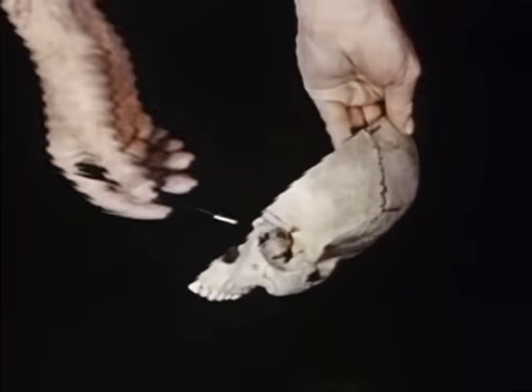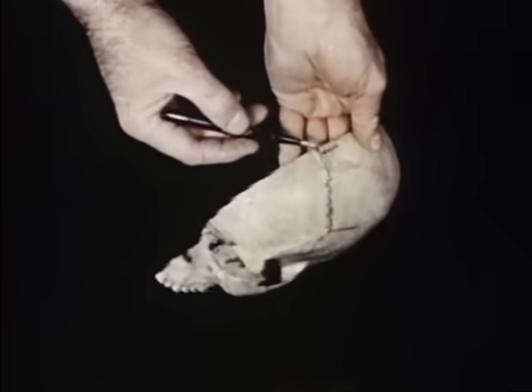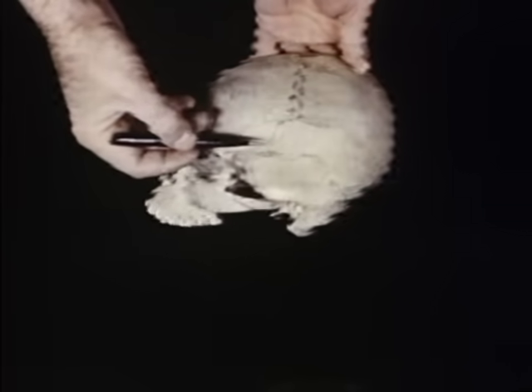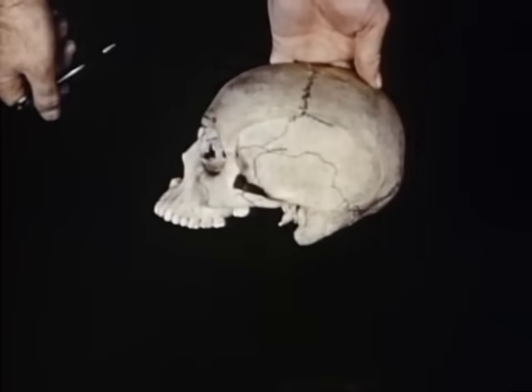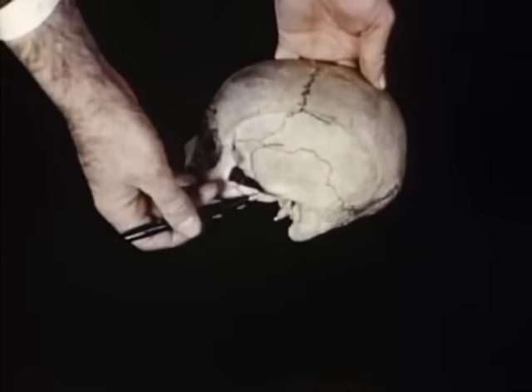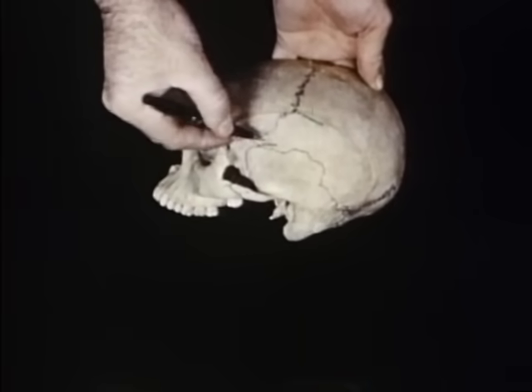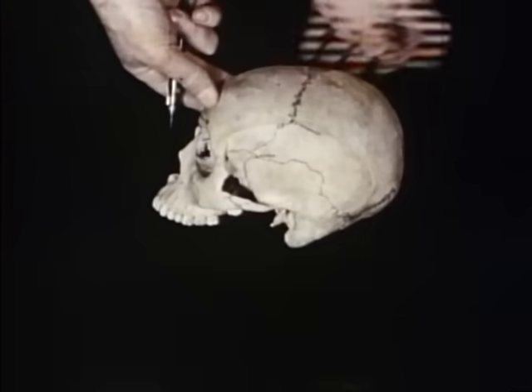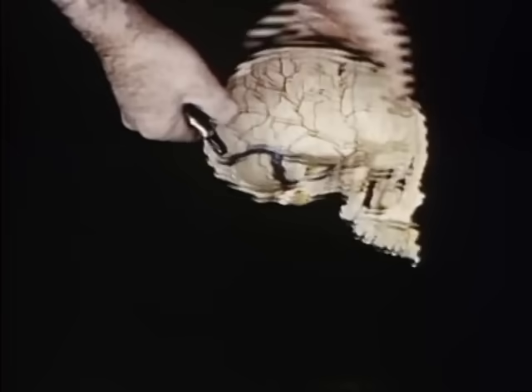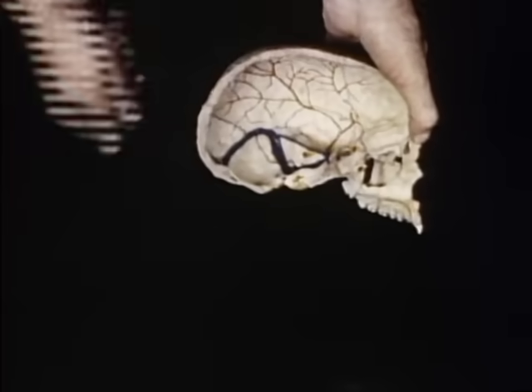at a point 13 centimeters behind the glabella, the coronal suture is outlined. Six centimeters above the zygoma in the coronal suture, the opening is made. This corresponds to a point close to the sphenoidal ridge on the interior of the skull.